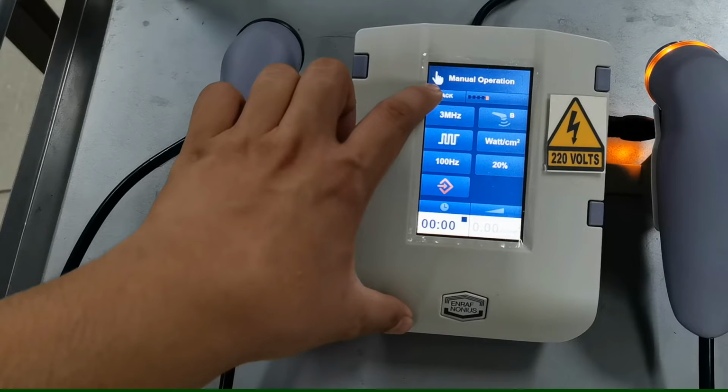So if I correct myself, this is for the depth of penetration. This is where you turn on the machine. You select this when you're choosing what ultrasound head to use, if it's ultrasound head A or ultrasound head B or both. Here is the timer.